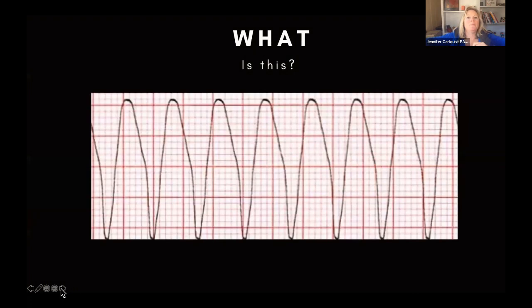Nice job. Now, this one's easy. Wide, fast, and regular. Okay, good. Yes, you guys all got it. You're all like VTAC, VTAC, VTAC on Zoom. Okay, good. Yeah, you guys nailed it. And Anne is also saying that it is VTAC. Strong work. Okay, so our question to this rhythm would be, is there a pulse or not, right? Are they stable, unstable? Is there a pulse or not? That would always be our follow-up question to this.